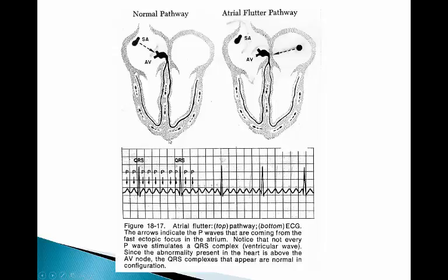Again, when the ventricular rate is greater than 100, it is uncontrolled, also known as a rapid ventricular response, or RVR. Once the ventricular rate is under control, then you should have normal cardiac output. So if your heart rate's above 100, your cardiac output is diminished, or compromised. But once your heart rate is normal, even though you have a flutter or AFib, then your cardiac output should be pretty normal, and your blood pressure and your perfusions should be pretty normal.